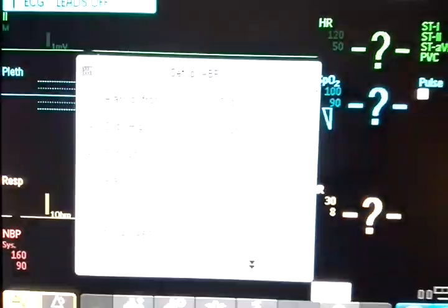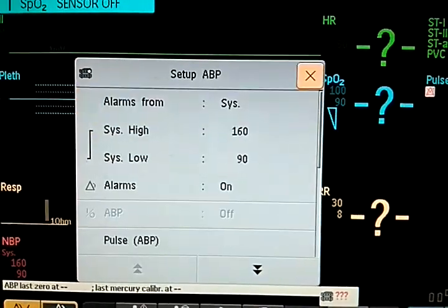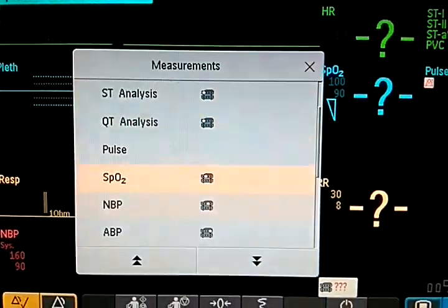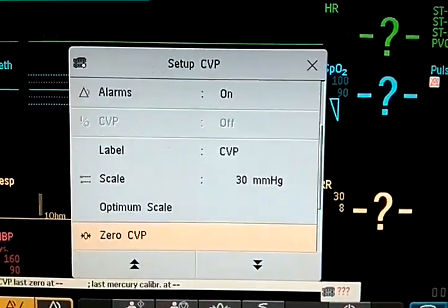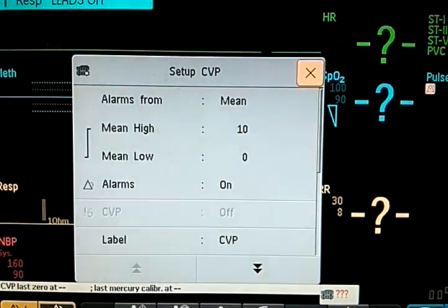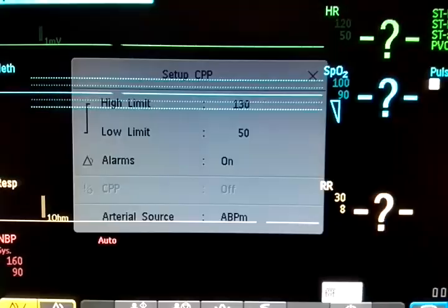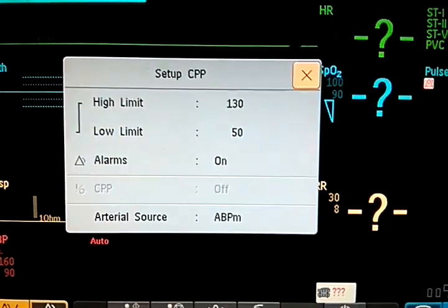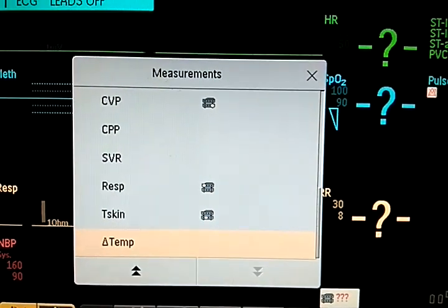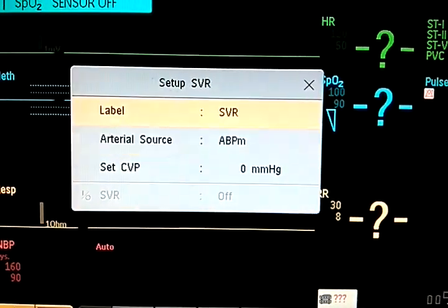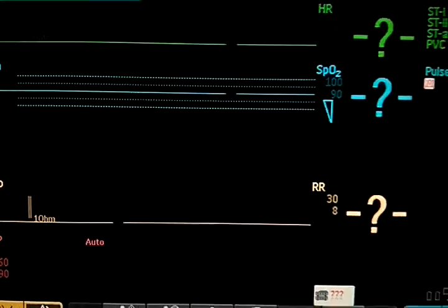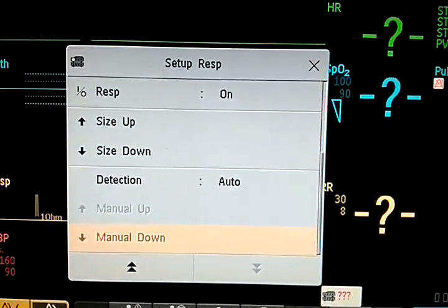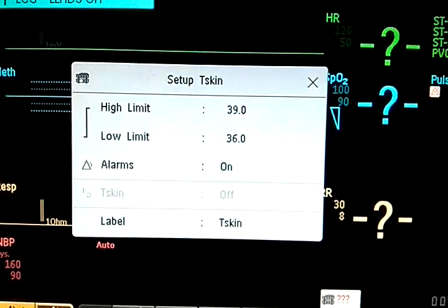ABP, CVP, CPP, SVR, respiration, T-Skin.